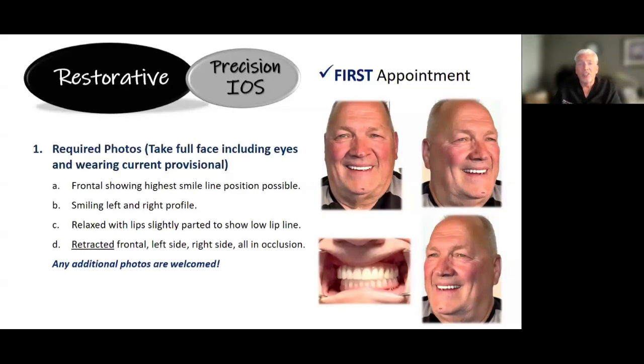And so we still love getting photos. We want to see the patients, get their eyes. We really like to see close to the top of their head, not much more than maybe an inch outside their ears, a couple inches below their chin. Let's see some left and right profiles, retracted images. So photos are so nice for us to have. It also helps the technician feel like they're working on a person, but it helps to see more the shape of their face as well.